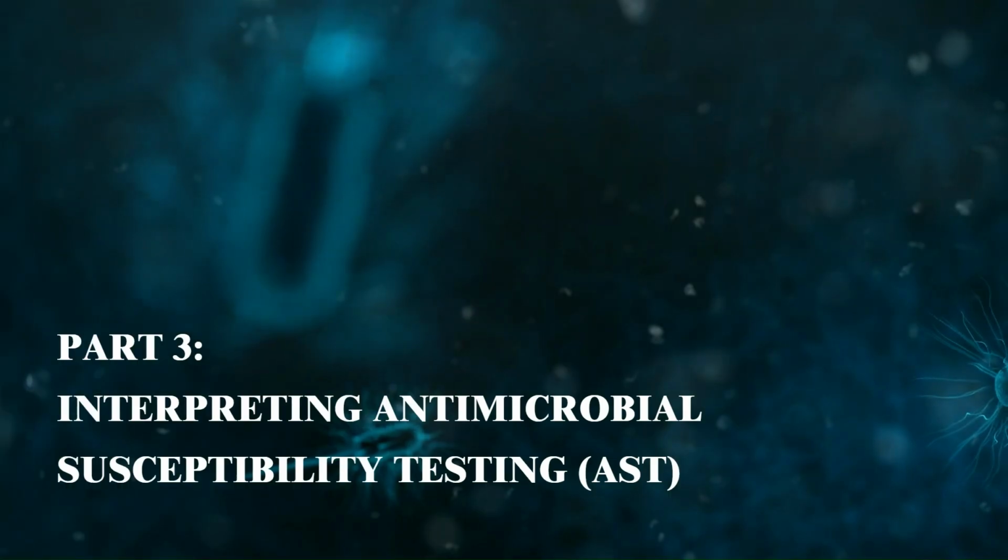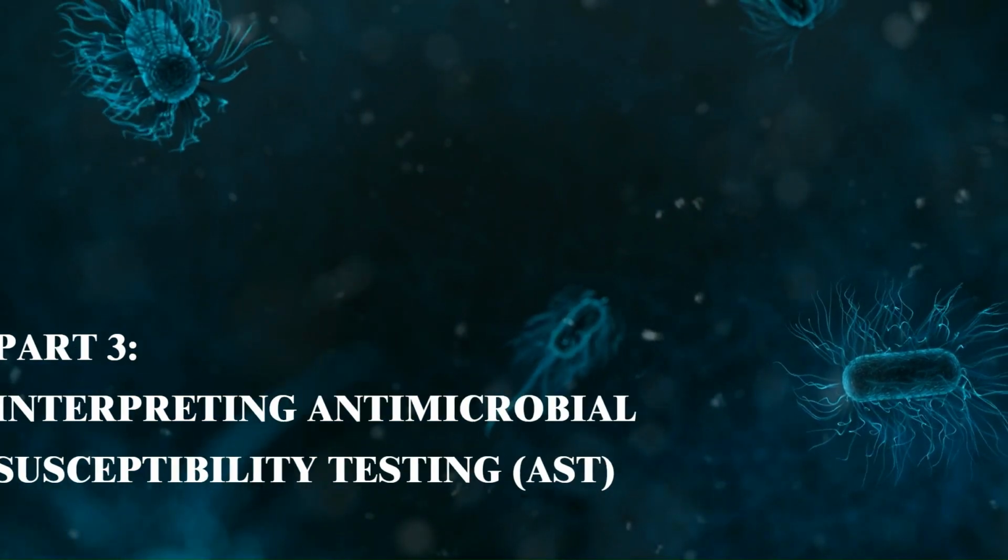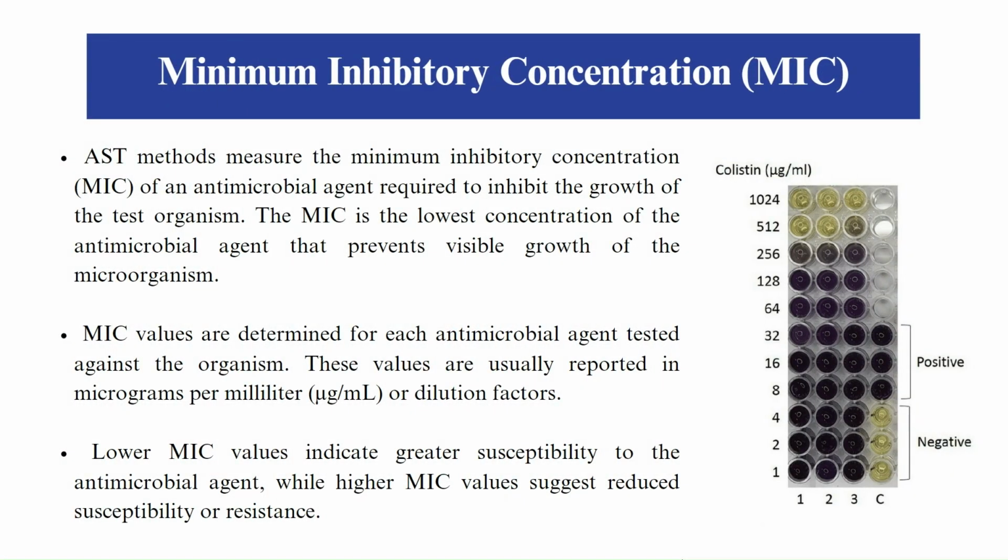So how do we interpret antimicrobial susceptibility test results? AST methods measure the minimum inhibitory concentration of an antimicrobial agent required to inhibit the growth of the test organism. The MIC is the lowest concentration of the antimicrobial agent that prevents visible growth of the microorganism. MIC values are determined for each antimicrobial agent tested against the organism. These values are usually reported in micrograms per milliliter or dilution factors.